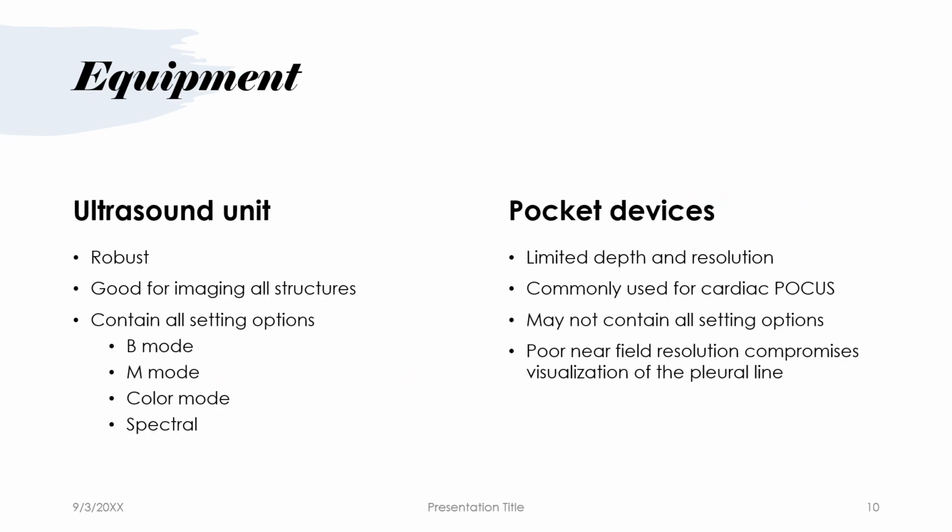Okay, the ultrasound units that we're going to talk about briefly, you can have any wide array of ultrasound units today, and lots of them can range from the hundreds of thousands of dollars to maybe just $2,000 or $3,000. And obviously, some of that price point is going to determine the quality of the machine that you get. What we were really looking for in these exams is a system that doesn't necessarily have to have all the bells and whistles, but needs to have adequate tissue penetration and a good enough spatial resolution that we're able to see what we need to see to get those accurate diagnoses.